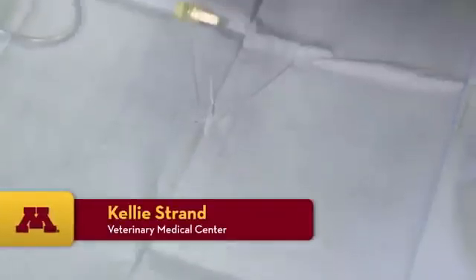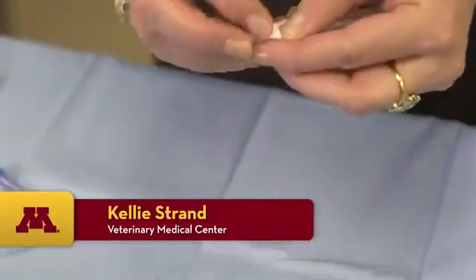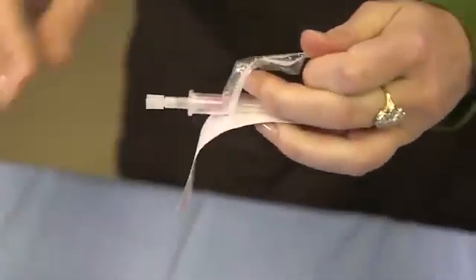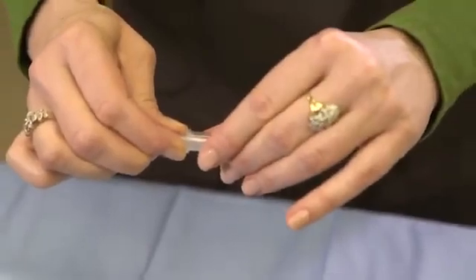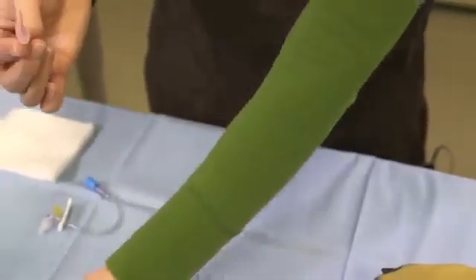Now we're going to discuss IV catheterization. Everything inside this package is sterile, so you want to be mindful of what you're touching and where. You can grab this. When you pull this off, you can get rid of your casing.